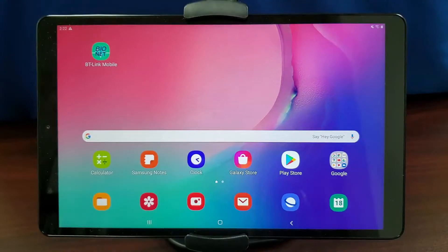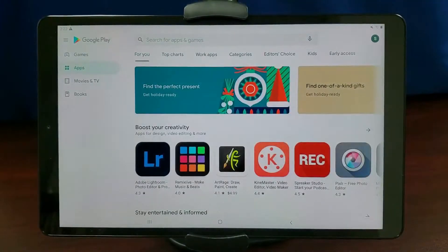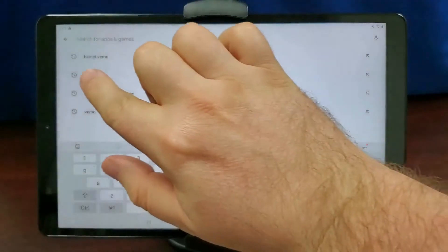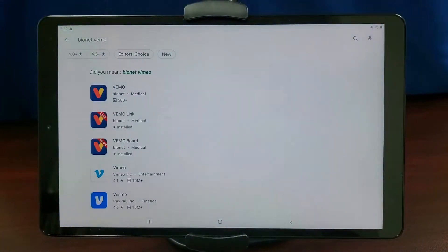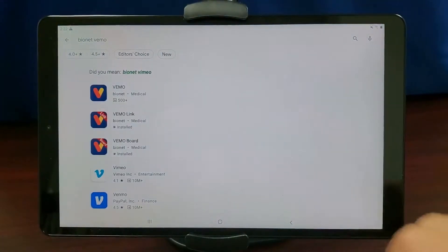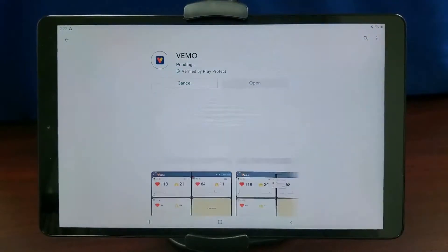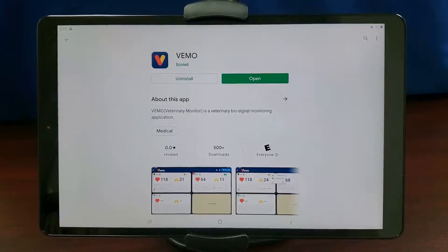To begin, tap the Google Play or App Store for your Android or iOS device. Click the search bar. Type Bionet Vemo into the search bar and tap Search. Select the Vemo app. Tap the Install button. Wait until your download is finished. Tap the Open button when it is done downloading.